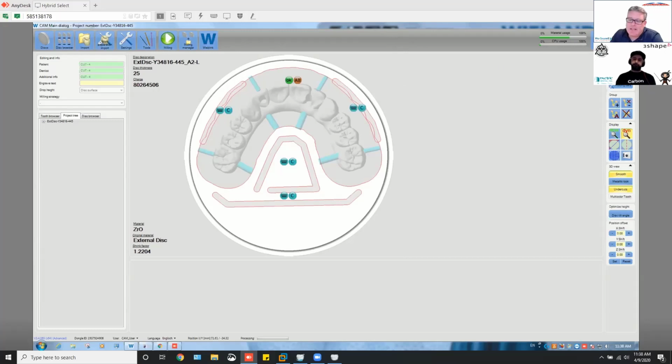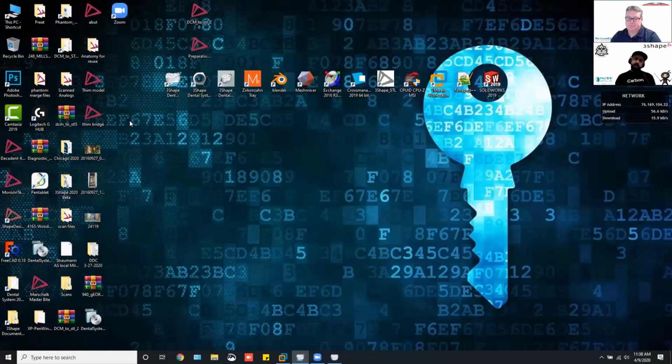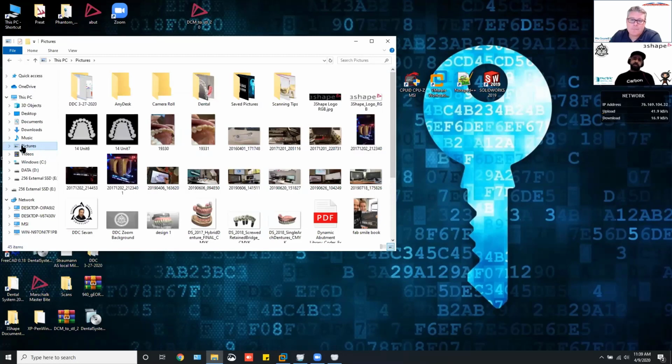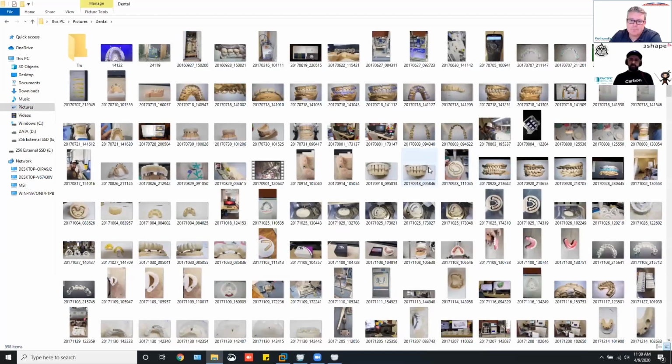Lastly, let's get into, how did your team finish? Did they finish in the green state, or do they do most of their contouring after it's been sintered? It's a little bit of both. If I do crown and bridge, the main thing that we will actually finish is the sprues. Really, I just clean the sprues down, and I would either use a finishing burr, or more like a rubber wheel. The white rubber wheel. Yeah, I use the ones from Brasseler mainly. That's a good one to go with.